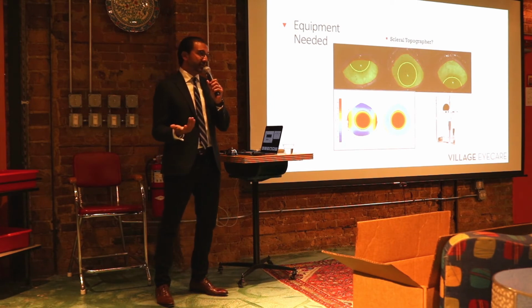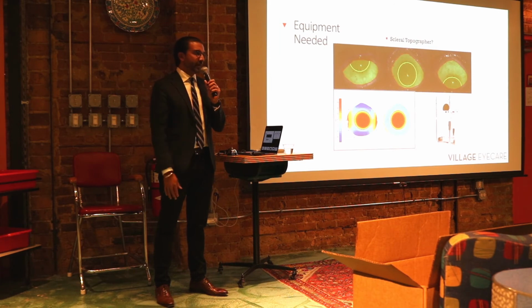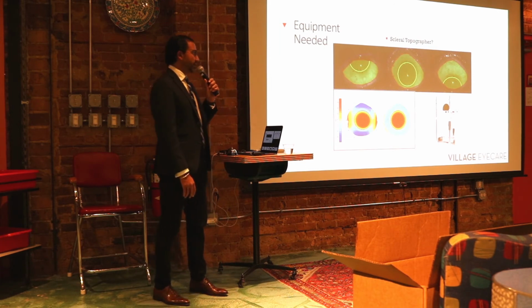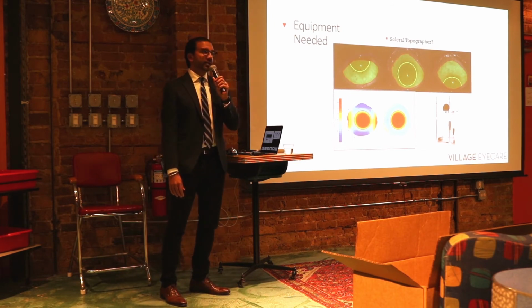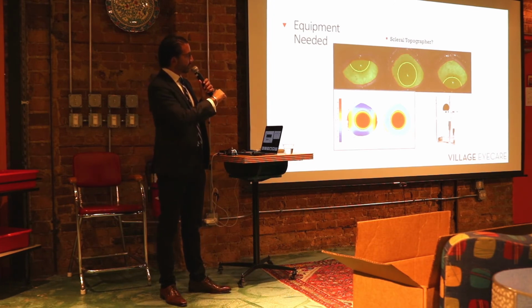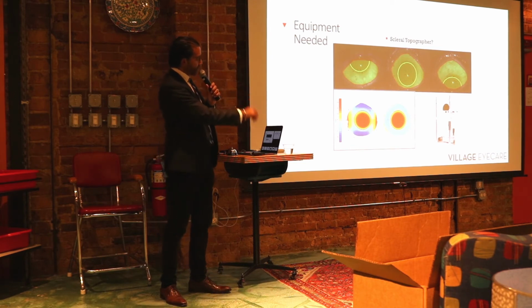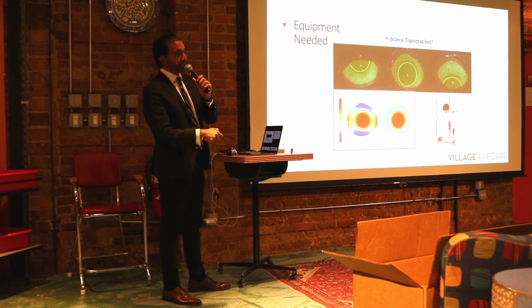And why it's important is if you fit a lot of scleral lenses, a lot of the troubleshooting arises from how the lens lands on the sclera. We also know that most patients, regular cornea or irregular cornea, likely have an irregular scleral shape. And with the scleral topographer, we are able to take a complete map of the sclera and identify the overall profile. This top image here shows the 3 scans that are required. The patient will look up, look straight ahead, look down, and then these 3 maps are stitched together.